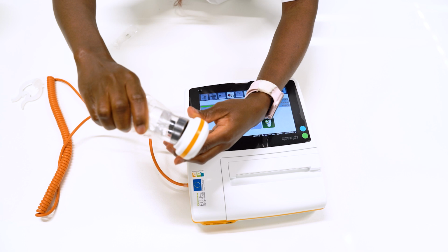Instruct the patient to take deep inhalation and exhalation. The nurse motivates the patient to breathe properly to get accurate results. A nurse is responsible for guiding the patient through each step of the process, ensuring their comfort and understanding. Now the spirometry device is turned on.